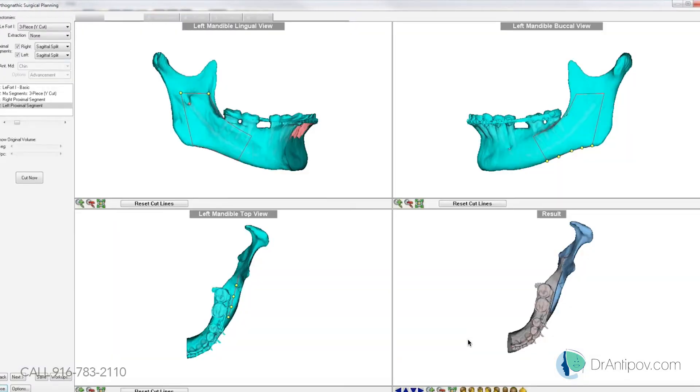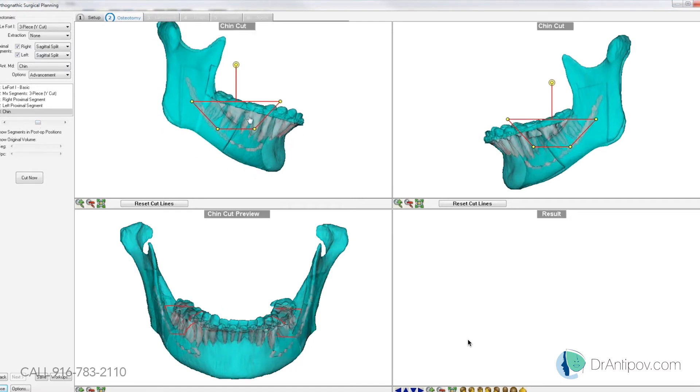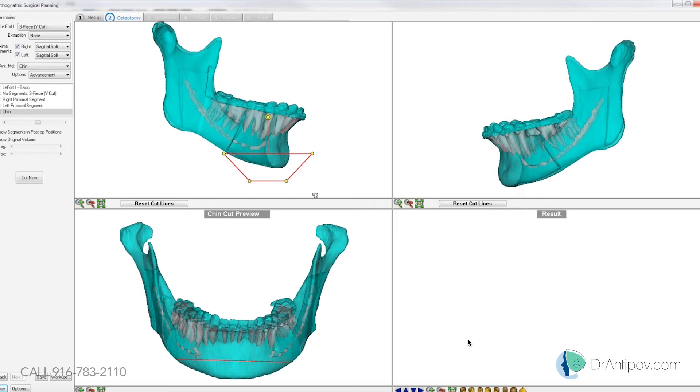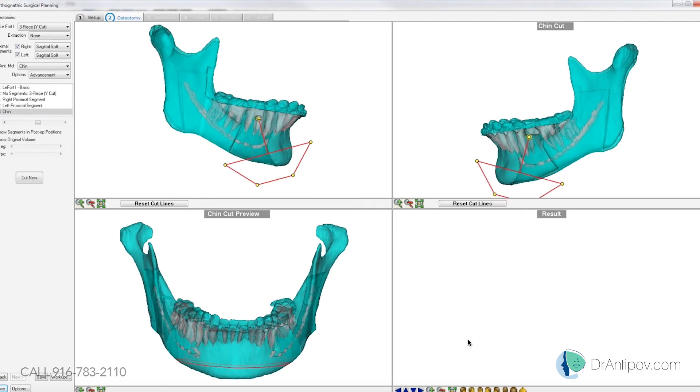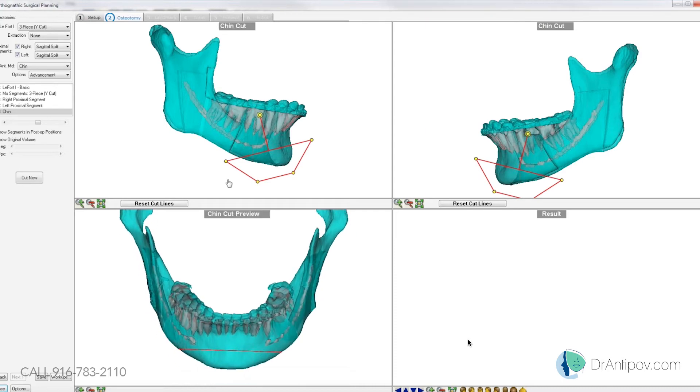Okay, you look pretty even now. And then you wanted to go ahead and take a look at that chin as well. Yes, chin — we'll do 5 millimeters down grafting and 3 millimeter advancement.